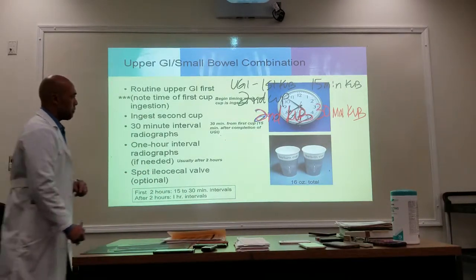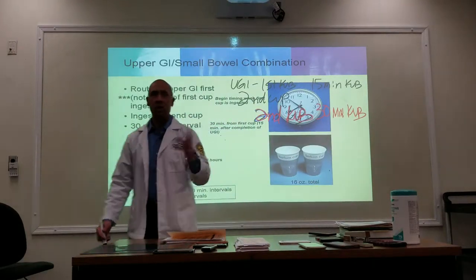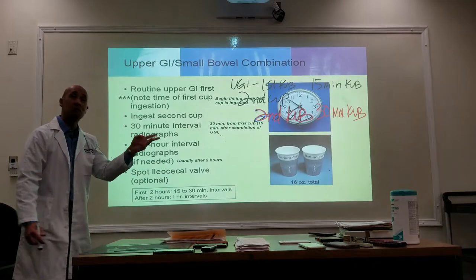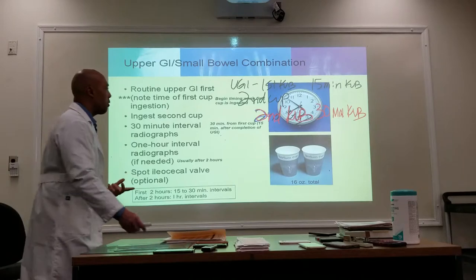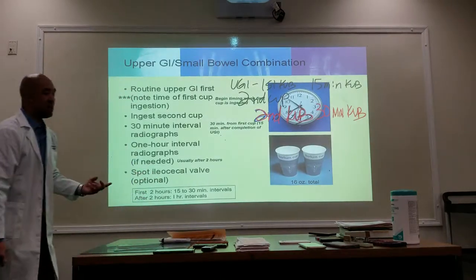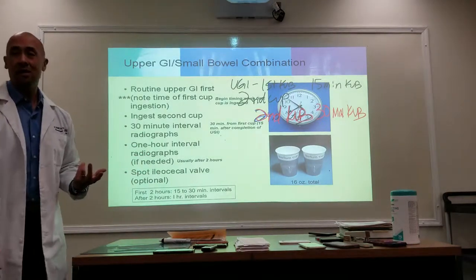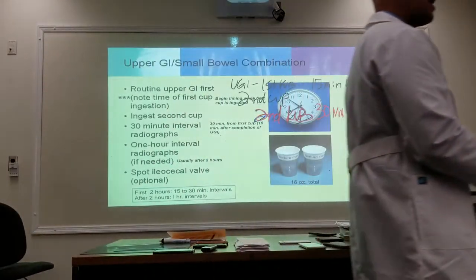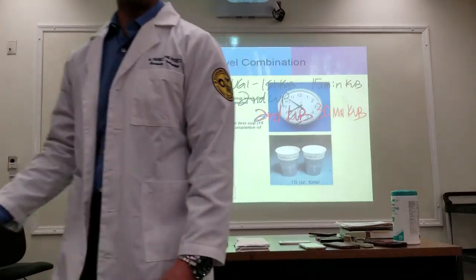So after I've taken this shot, I'm going to share my radiograph with my doctor, and I have to wait another 30 minutes to do my next KUB. You guys follow? While we're waiting for the next KUB, it can be 15 minutes, it can be 30 minutes later, I'm going to have my patient get up and walk around, because we're trying to get that contrast through their small bowel. They're not just going to sit, they're physically going to get up on their feet and walk around the department.